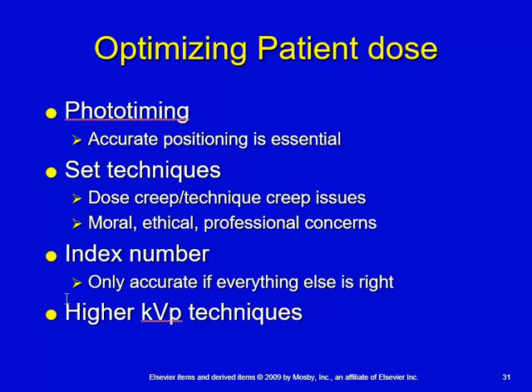And then again, utilize higher KVP techniques whenever you can. KVP doesn't affect your contrast nearly as much as what it used to on screens and films, so you can naturally use a little bit higher of KVP. That's not to say that you want to use maximum KVP with every single patient, but there's a little bit more flexibility in usage of higher KVP.